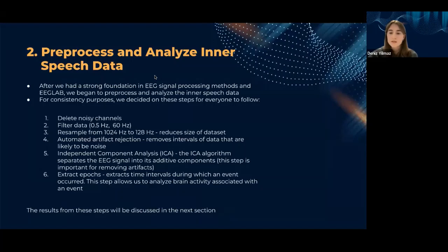So after running ICA, we extracted epochs from the data, which allows us to analyze brain activity associated with a particular event during the EEG recording. The results from these steps will all be discussed in the next section.